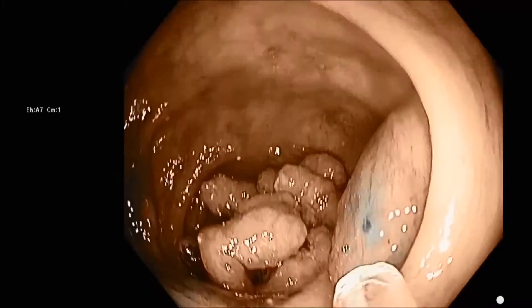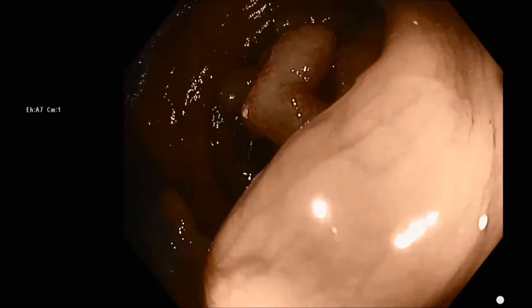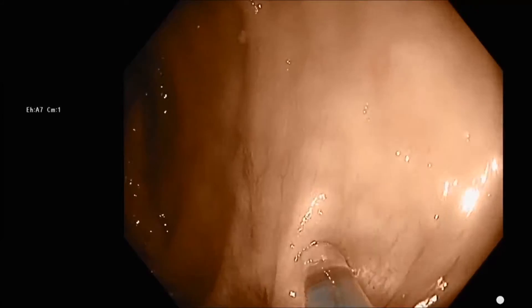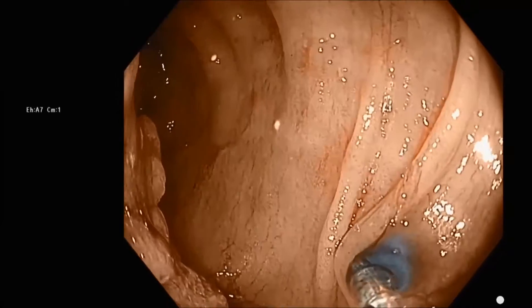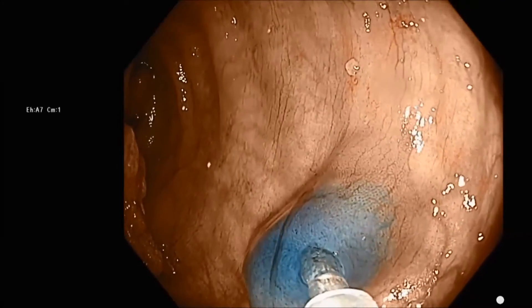Indigo carmine is not an effective tattoo, but it allows you to see the bleb technique really clearly. We're rotating the scope, using rotation and right-left turning to get into the best position where we're sort of tangential to the mucosa, and we're making four blebs here with our EMR fluid.